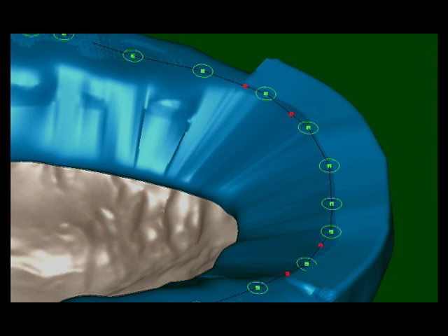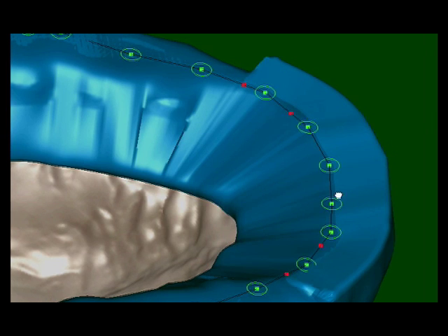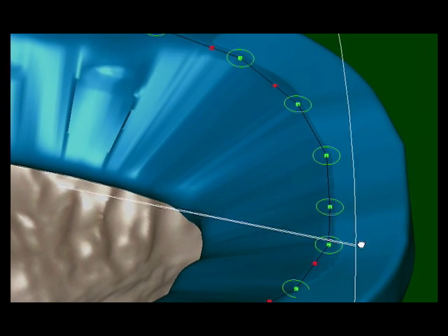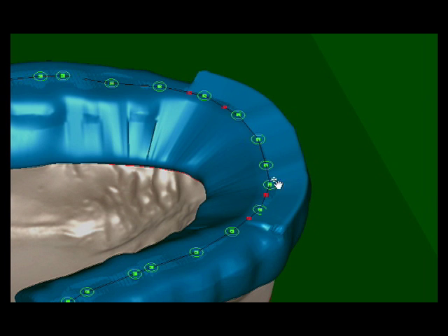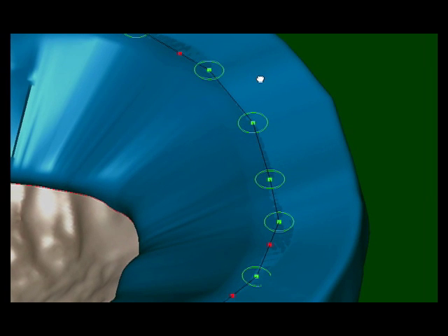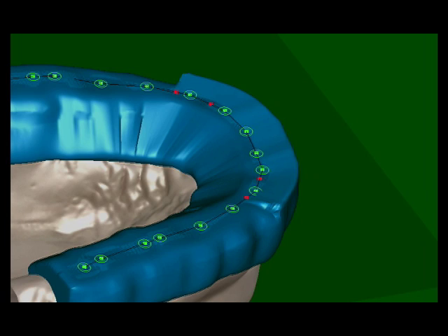Software also allows the width of horizontal shelves adjacent to the ramp to be specified. Here we see a CR splint designed without a shelf, a 1mm shelf, and a 2mm shelf.